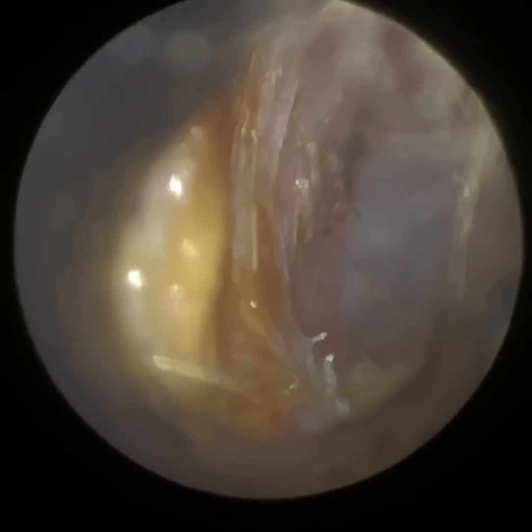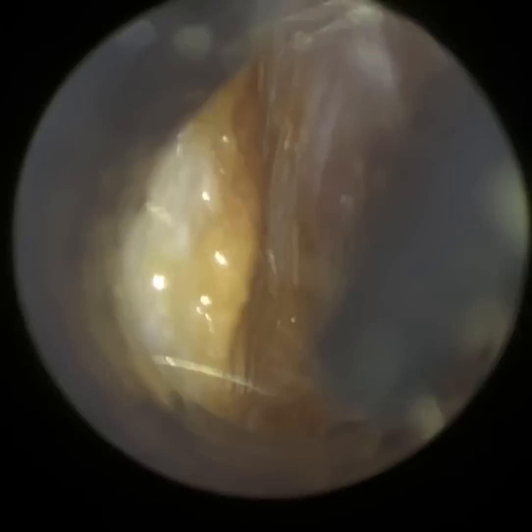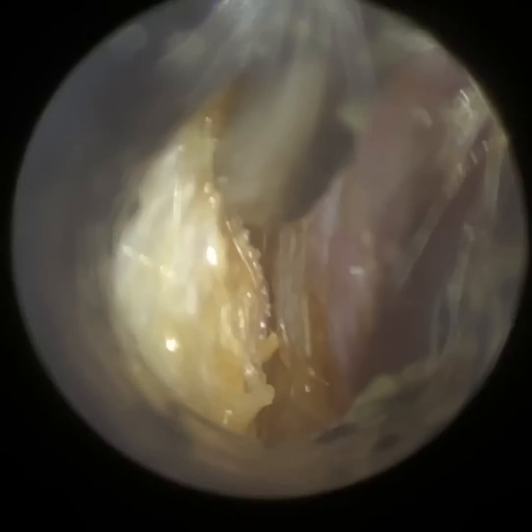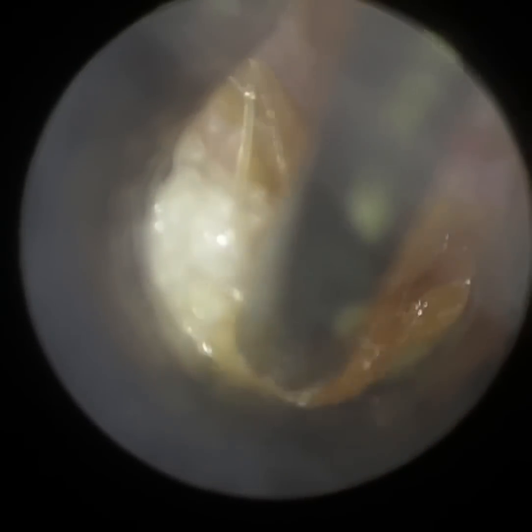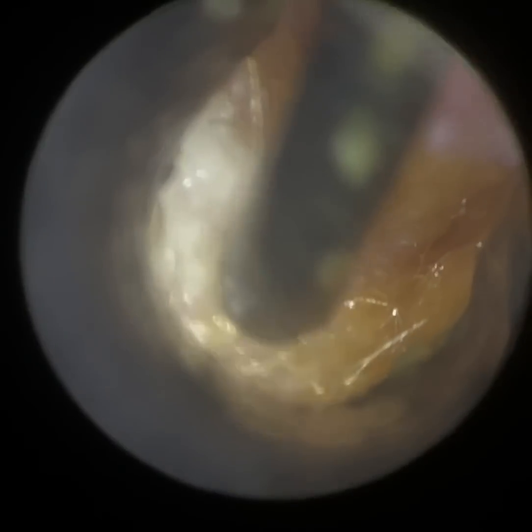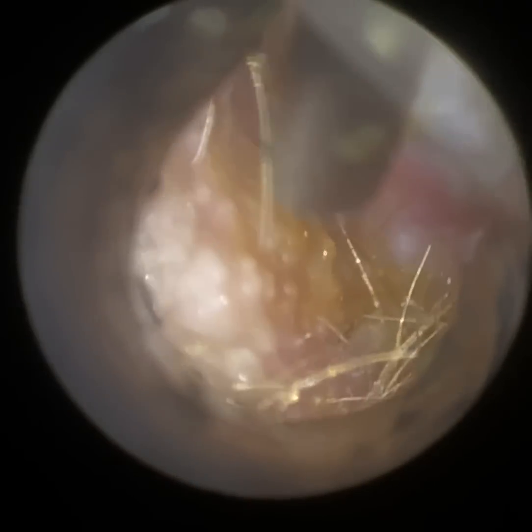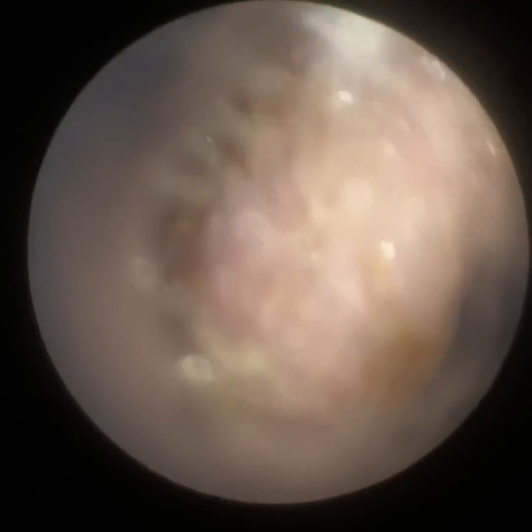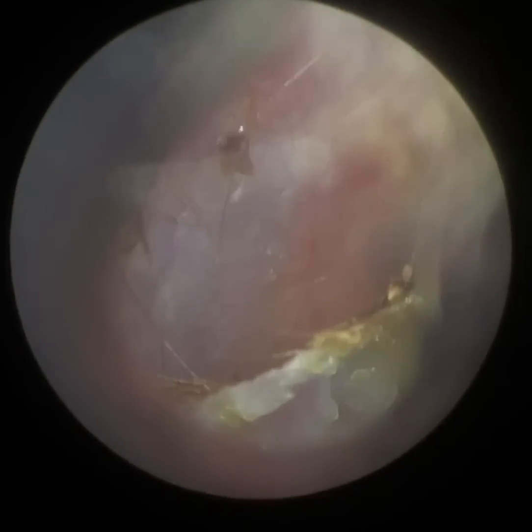What are the causes of that in this particular patient? Some patients have an anatomical defect of the ear canal where they've got a trench or dip within the ear canal. As the skin migrates off the eardrum towards the entrance, it can get trapped and collect within that anatomical defect. That skin then gets infected, forms a plug, and can expose the bone of the floor of the ear canal — the temporal bone — and then the bone can get infected and that infection can spread. It can be quite dangerous if left alone, because it can start affecting your jaw and move superiorly towards the brain.